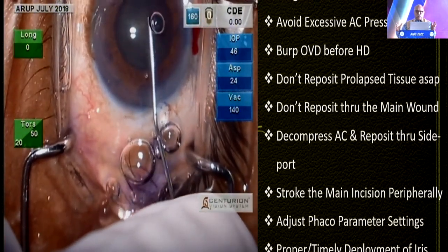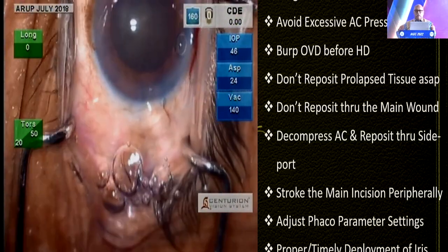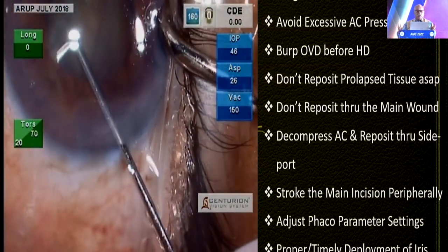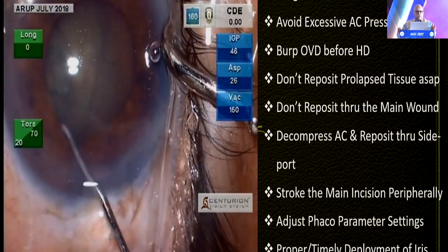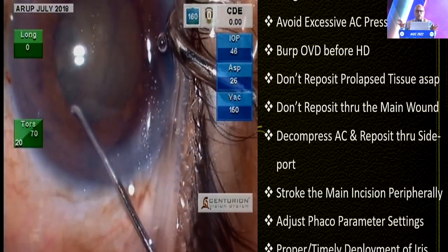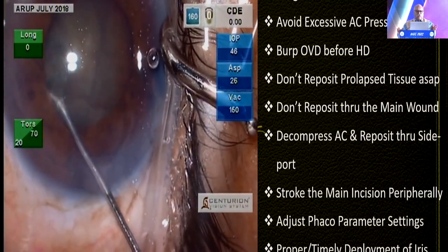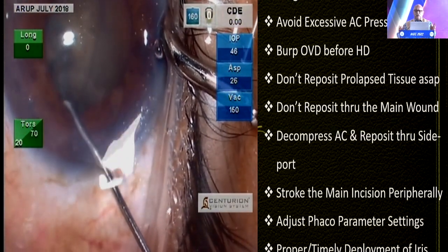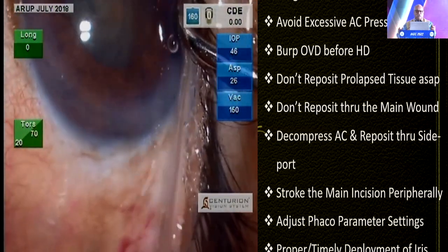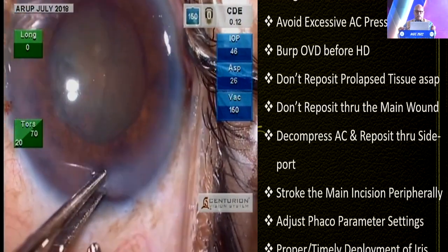Even if you have a pupil coming down during the course of surgery, if your rhexis is 5.5 millimetres in size, intraoperative management of the small pupil syndrome is very easy. Using the Chan cannula and performing cortical cleaving hydrodissection, if you see the sub-incisional iris, there is a tendency for the iris to tent up — it doesn't prolapse, but it tents. Make sure hydrodissection is done very slowly, because you don't want rapid buildup of intraocular pressure pushing the iris through the incisions.